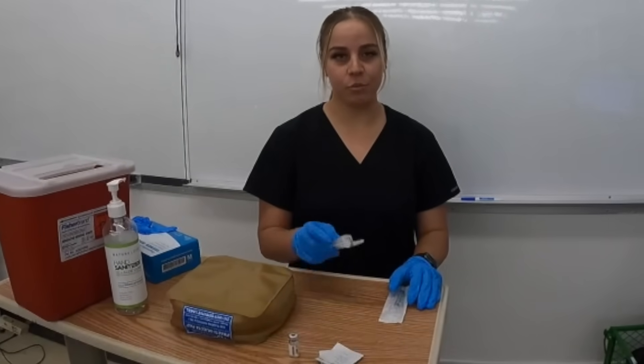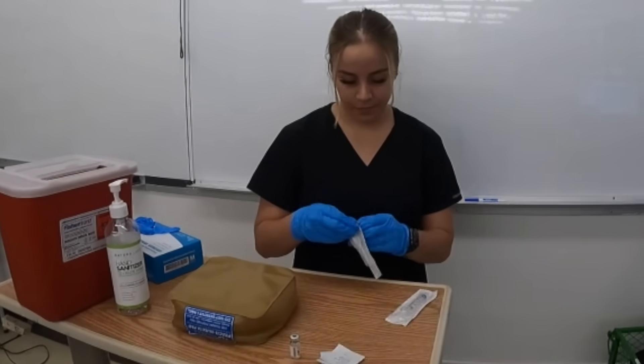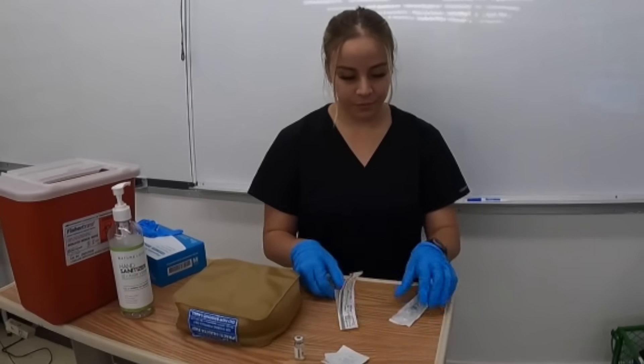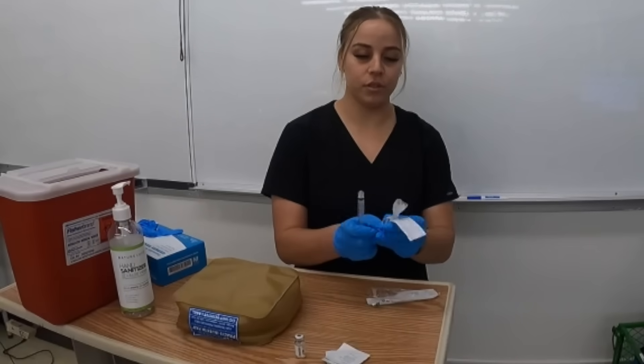Now I'm going to prep my syringe, so I'm going to start opening up the packages and attach the needle to the syringe.